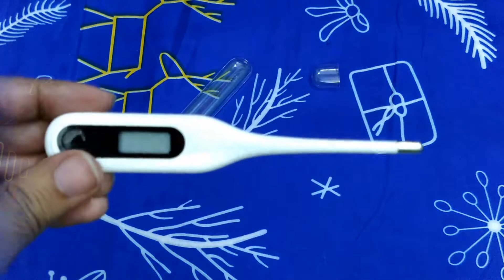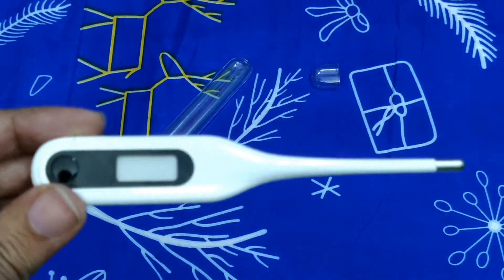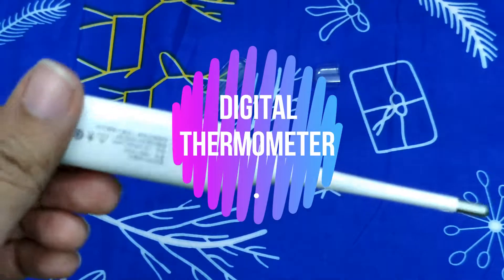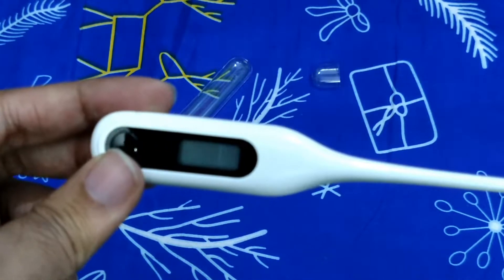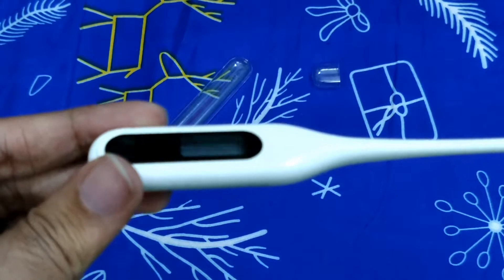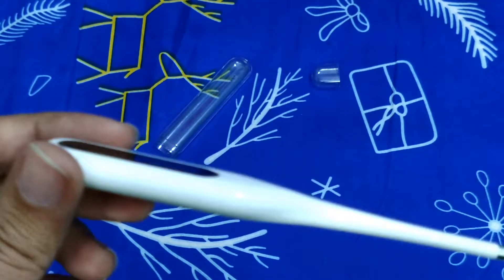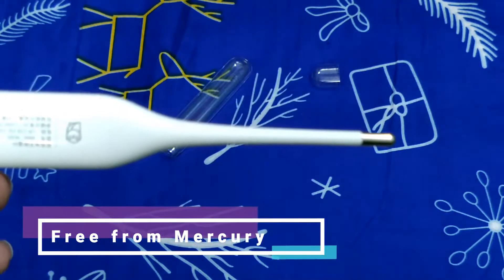This thermometer is a digital thermometer from the Xiaomi Mi family. It is quite audible and fast, and can basically measure temperature in Celsius. It can be used orally as well as for the armpit, offering dual use.